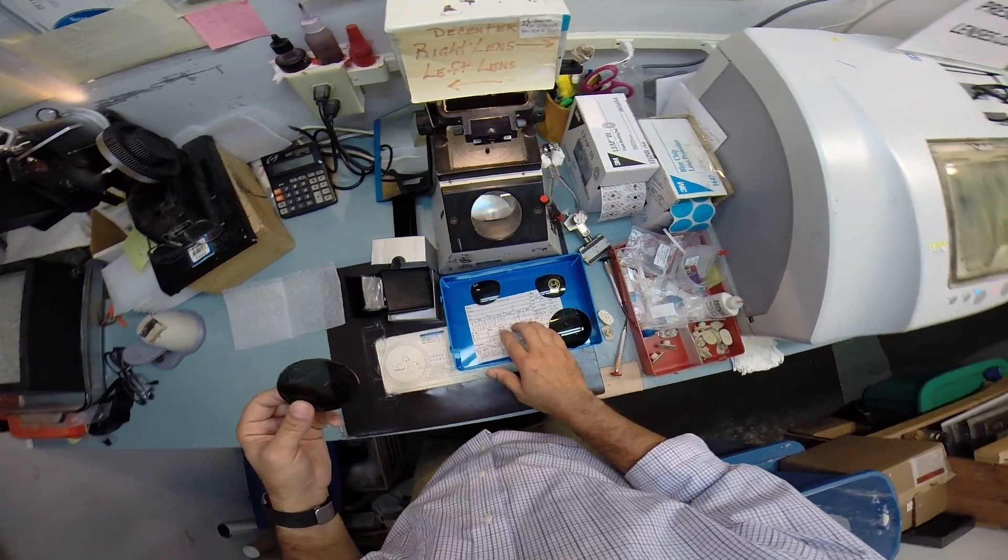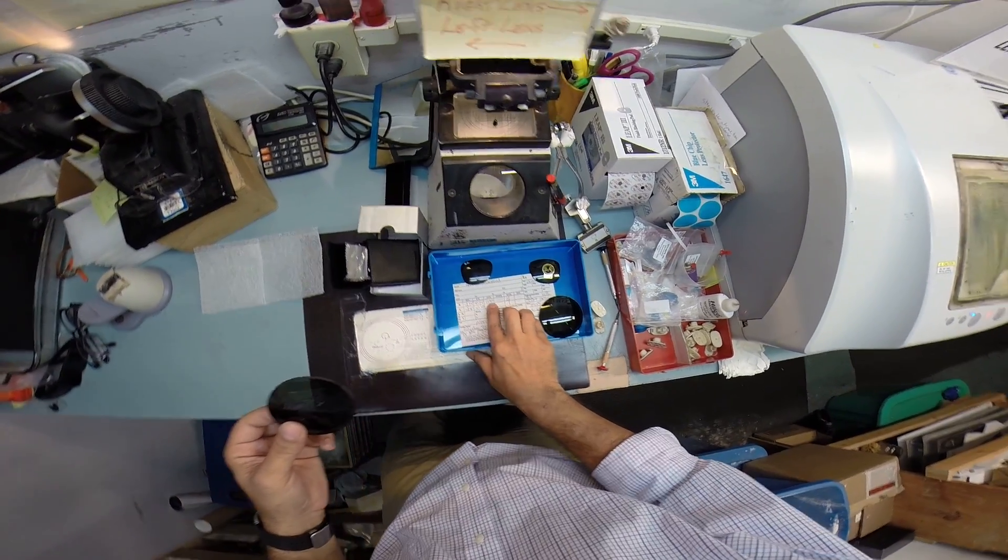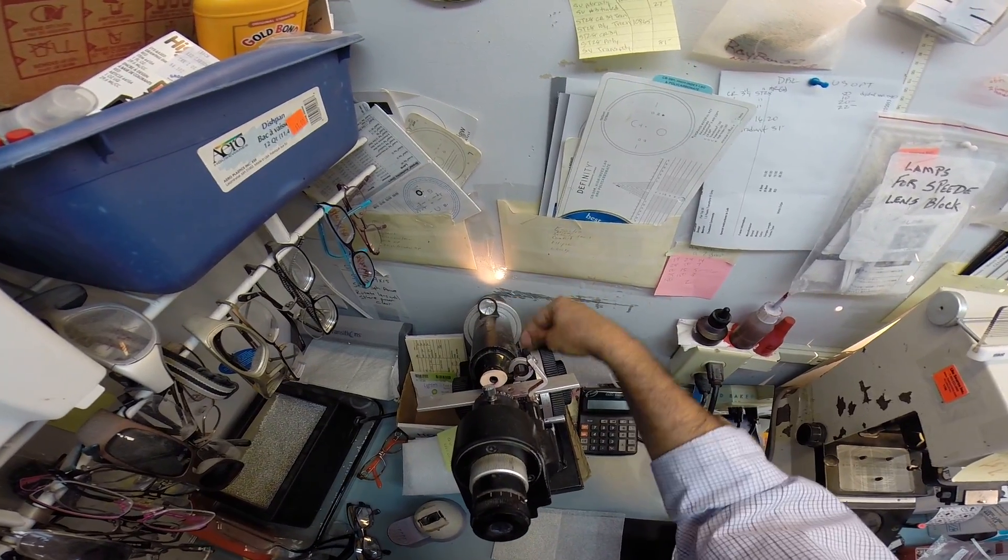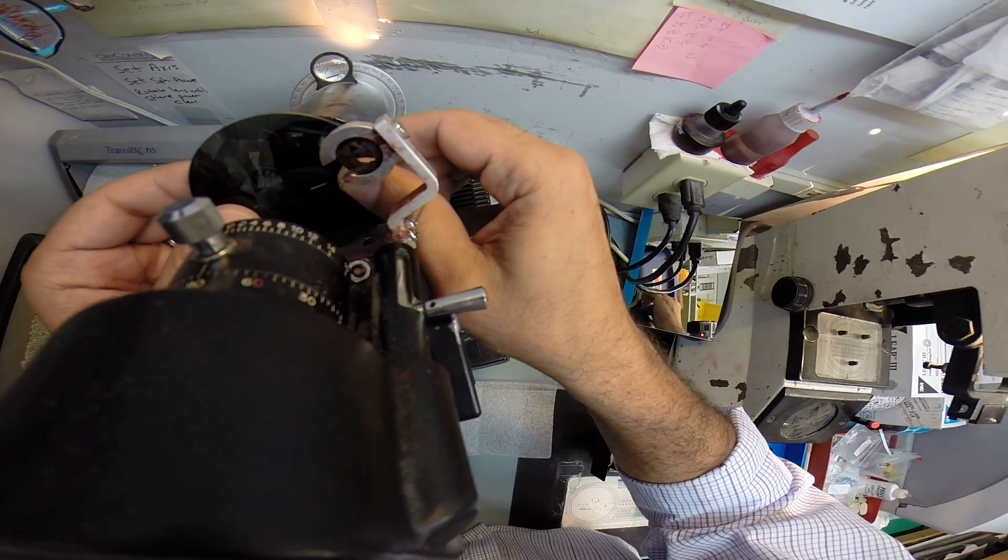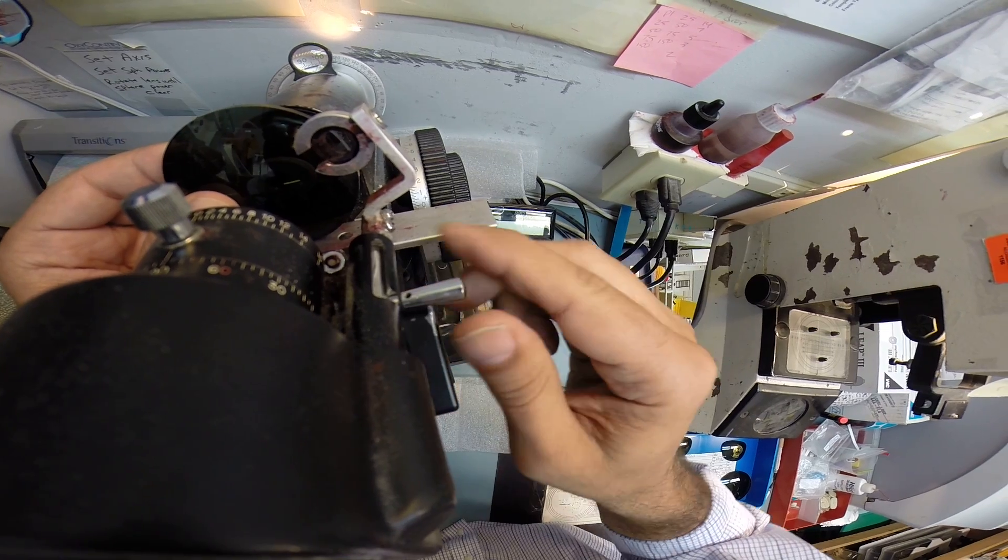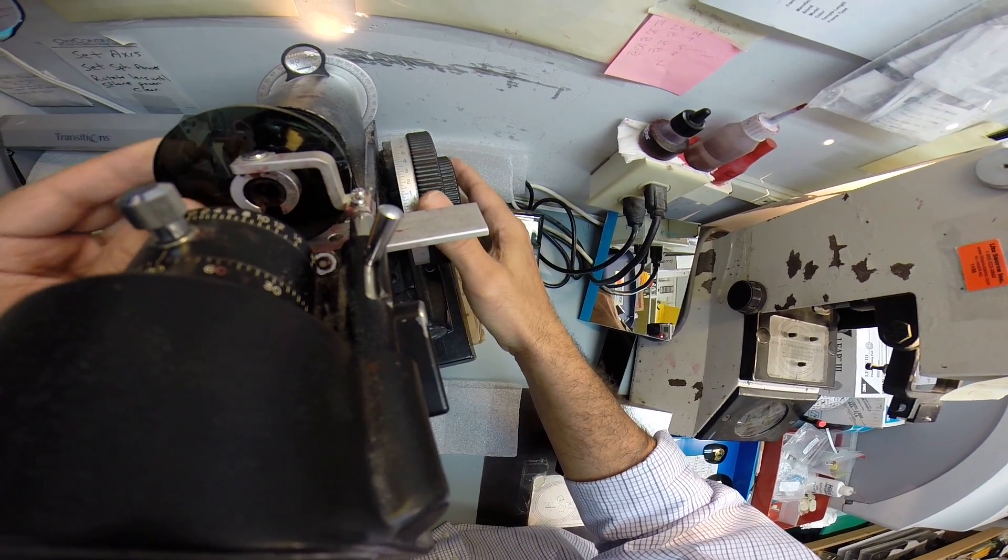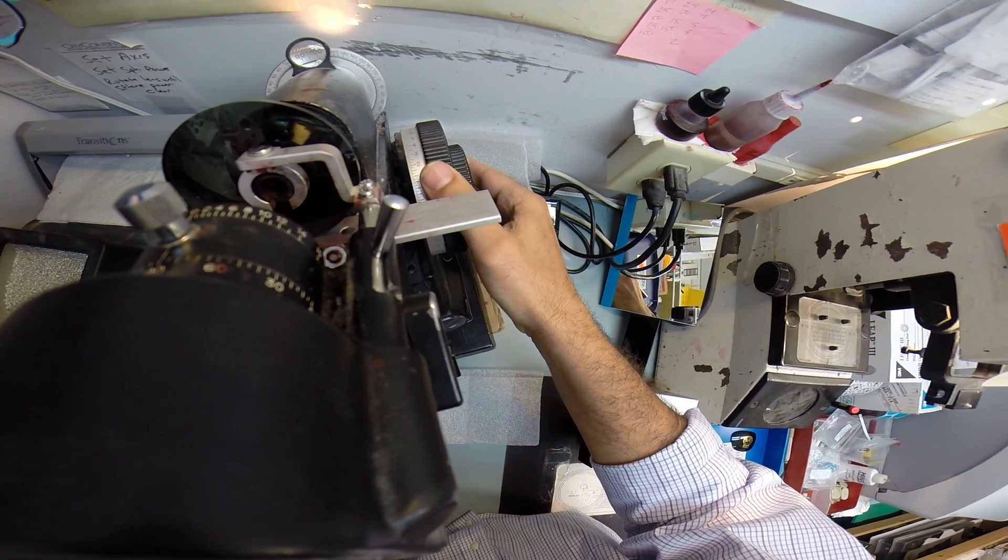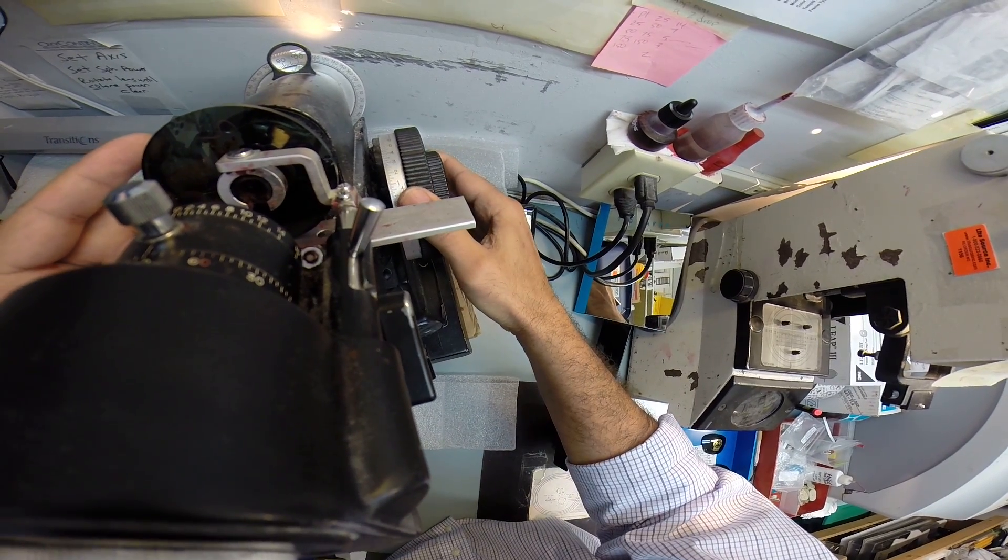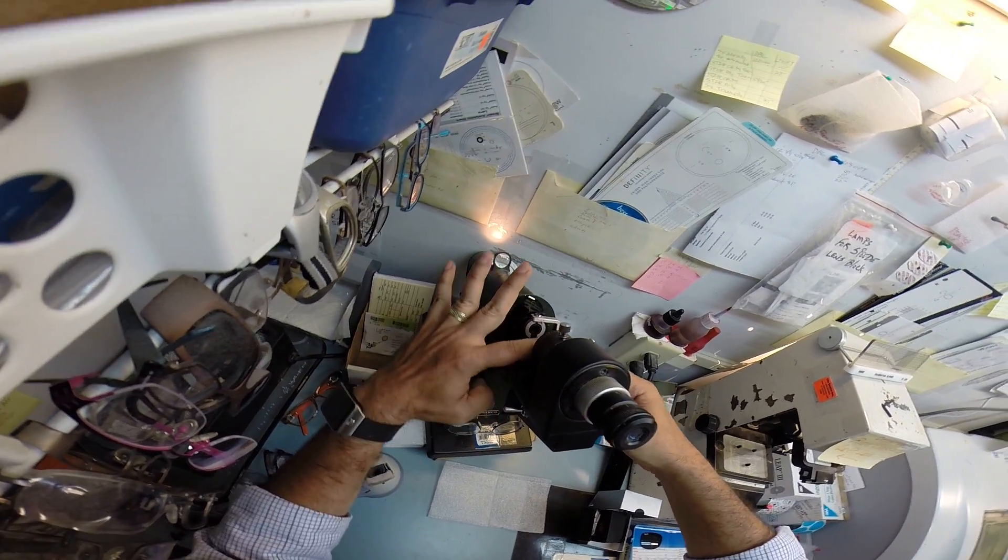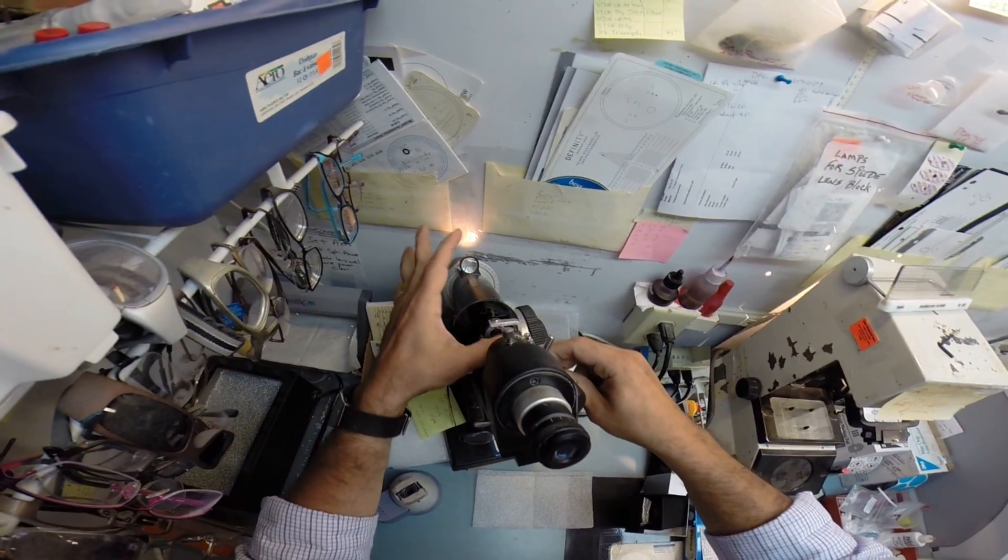So let me get your right lens ready. Your prescription reads minus 2.75, minus 0.75 at 100. So I'm going to spin the axis wheel to 100. I'm going to set the power drum at minus 2.75. I'm going to put your lens in there and rotate until the sphere power comes in clearly. And now would be a good time for you to observe how dusty the top of my lensometer is.